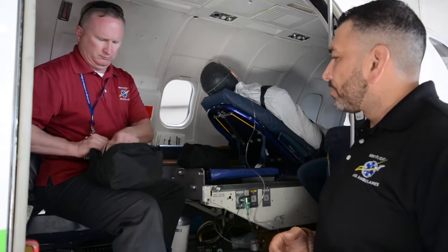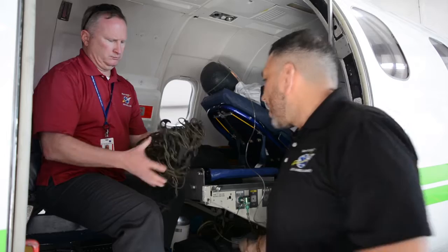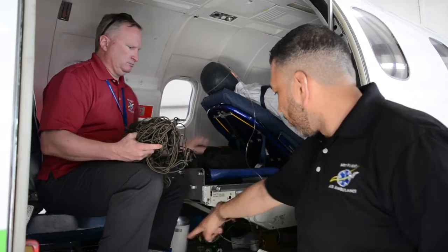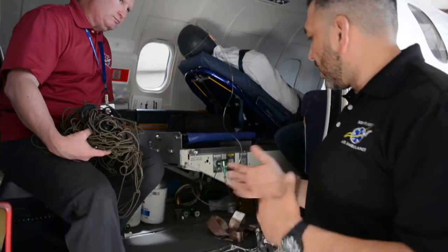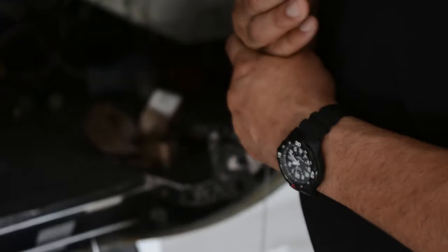So here's our extenders, and we have two now, so you could use one for the aft seat in the back, and you could put one up here if there's multiple backpacks or a first in bag. We have this netting, so we could actually put over everything, hooking into these round eyelets that are located here on the floor, and we can make sure that everything is secure and that if we were to have to make any kind of rapid descent, things aren't going to fly around. So per FAA regulation, we should be using netting and everything being secure for flight.